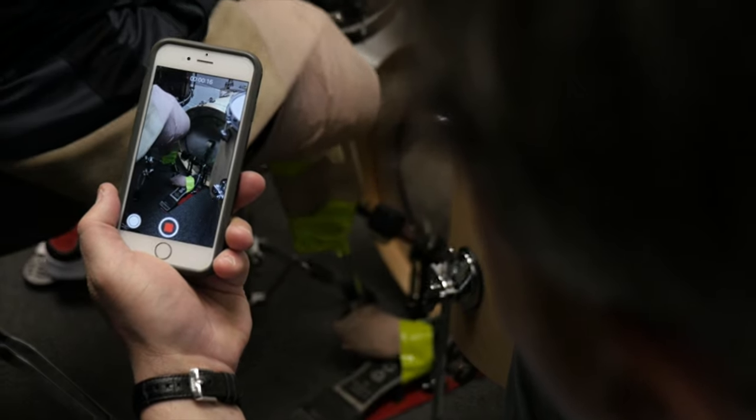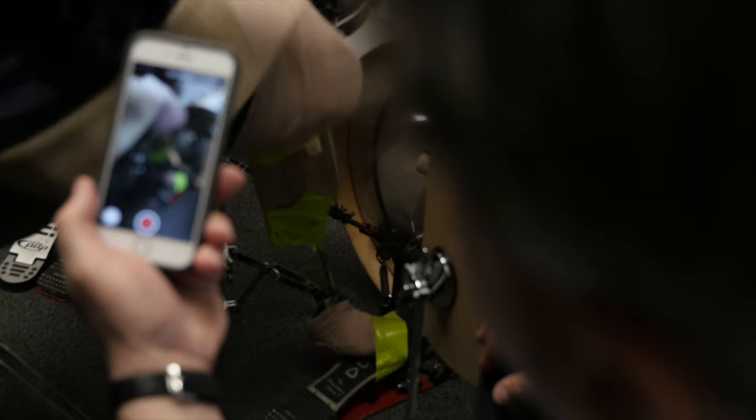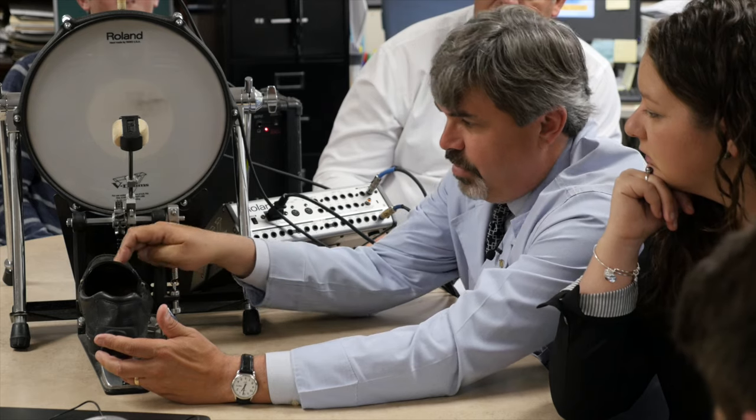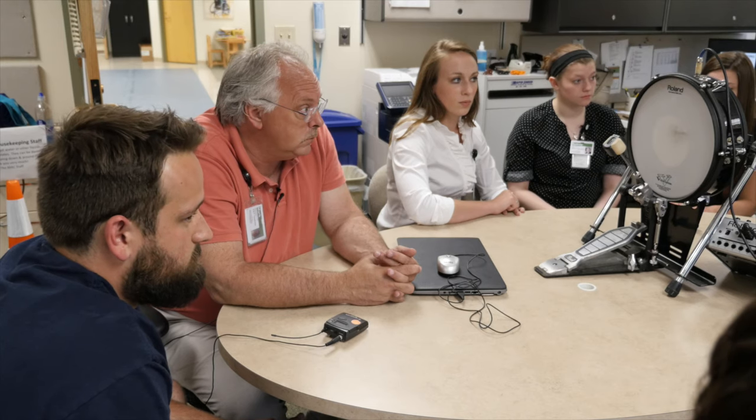I pictured attaching it posterior distal so that the force is underneath. If we found out that was the best place for it, why can't the socket be three inches longer than his anatomical? He's not going to walk in it. Really what drummers do is lift their foot and their forces are translated right into that spot. Maybe a saddle joint — saddle joint with rotation to modulate angle and then rotation in the medial-lateral direction, so he can shift forwards and backwards to change the insertion angle, without changing anything physically at the artificial knee fixed angle.